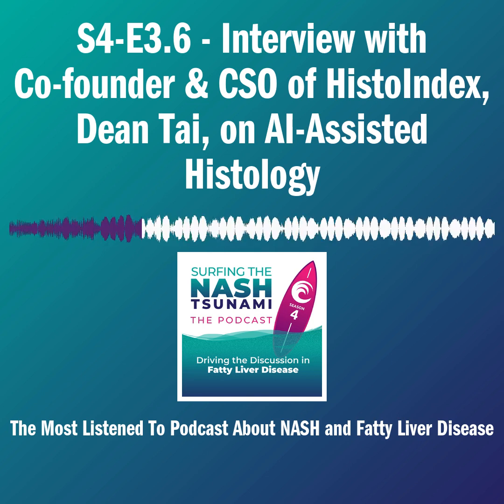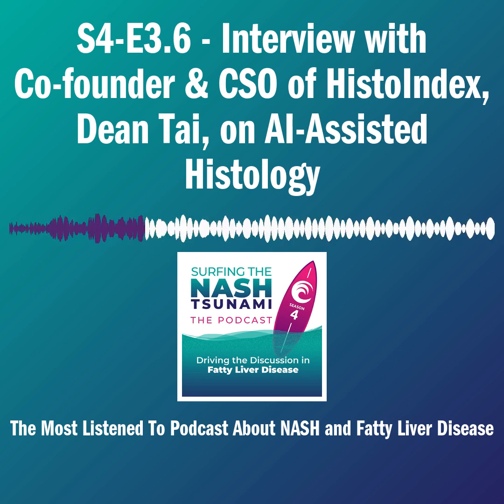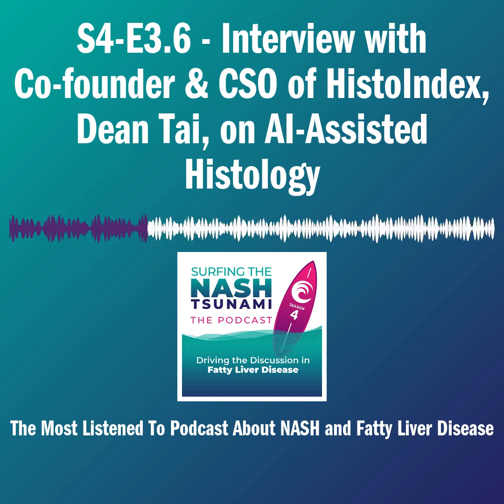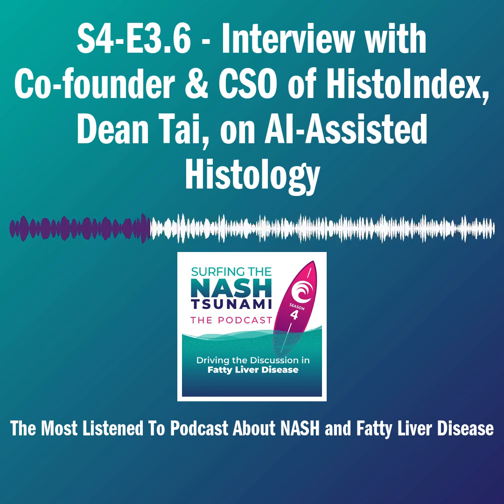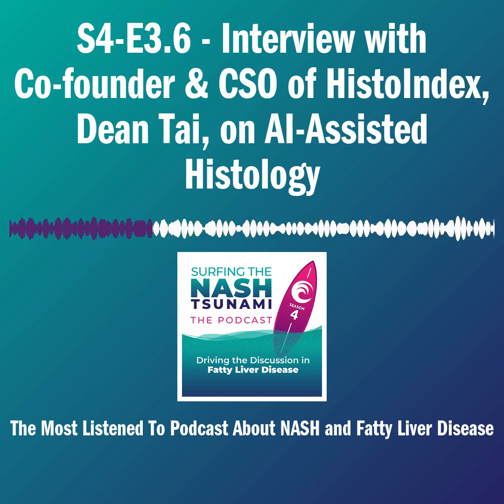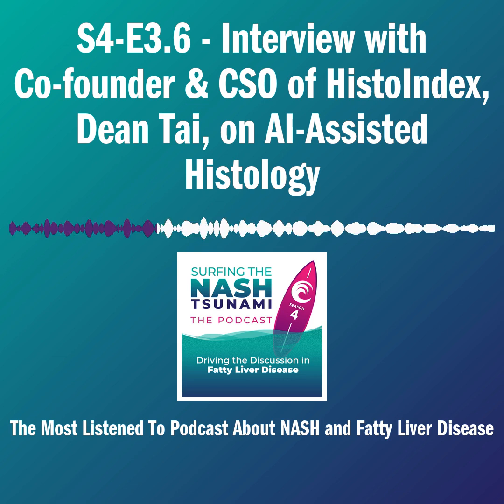Thank you, Jörn. So maybe just share a bit more specifically what we did. We use AI to really normalize steatosis reduction, AI being widely accepted for assessing steatosis in liver. And another advantage is that AI can help us dissect the liver into zones like the periportal zone, pericentral zone, zone 2, etc. So what we have done in the aldafermin study is, as you mentioned, using fully quantitative assessment, we can now see a statistically significant fibrosis reduction. But with this detailed assessment with the steatosis correction and the zonal analysis, we found that the statistically significant reduction of fibrosis is most potent in the periportal region. So these are the kind of assessments that the AI can help to find in a very reproducible manner.